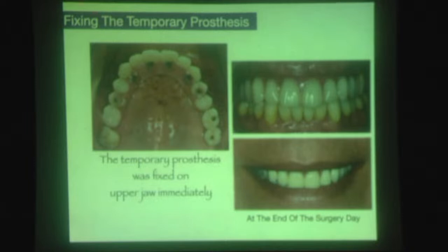You see the occlusal view, you see the front view, and at the end of the surgery day, we didn't wait. We prepared everything in advance prior to the surgery. After the surgery, we only take a precise impression, and then we make the stone model, the prosthesis meets it, then we finalize at the end of the surgery day.